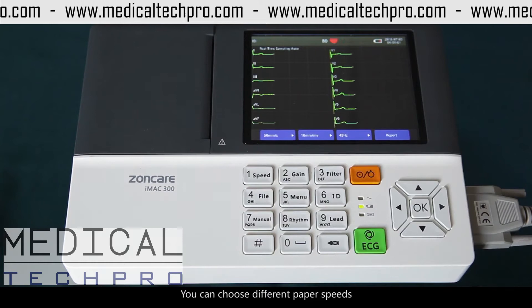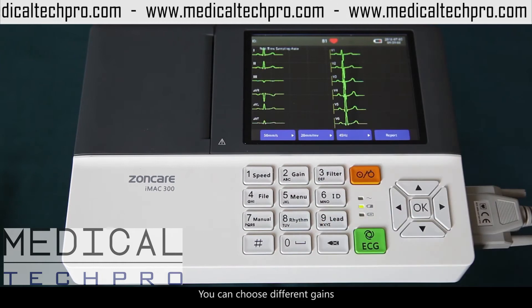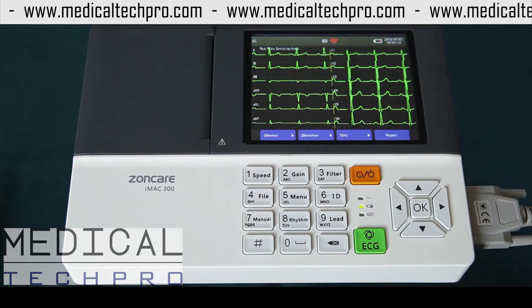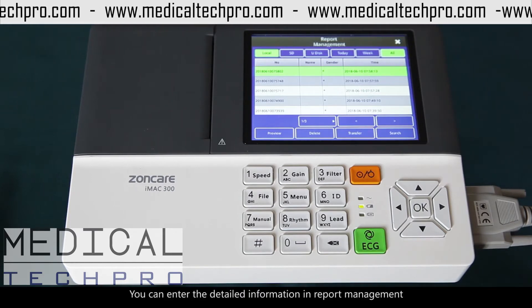1. Speed — you can choose different paper speed. 2. Gain — you can choose different gain. 3. Filter — you can choose different filter. 4. File — you can enter the detailed information in report management.